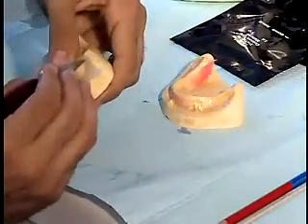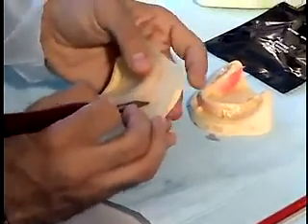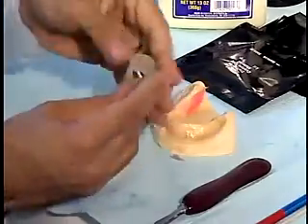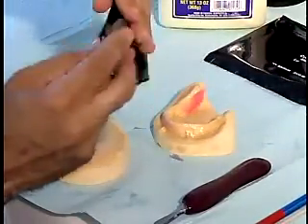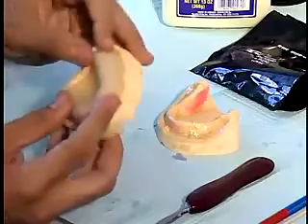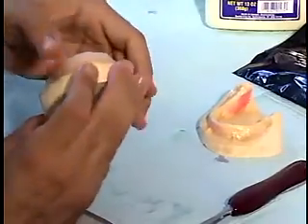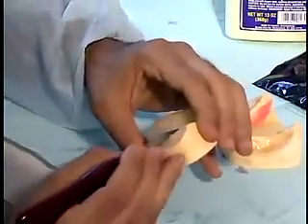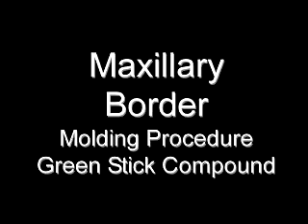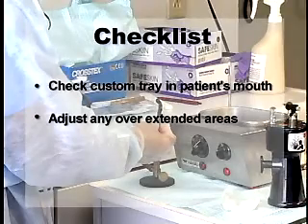Carefully trim the material to the red line previously marked. Make the borders of the tray as smooth as possible prior to curing the resin, as it's much easier to smooth it when soft. Take care not to use excessive finger pressure and thin out the resin. Check the custom tray in the patient's mouth and adjust any overextended areas.